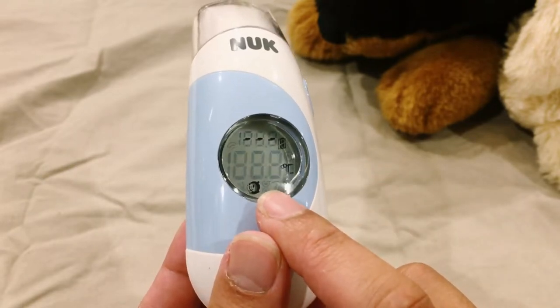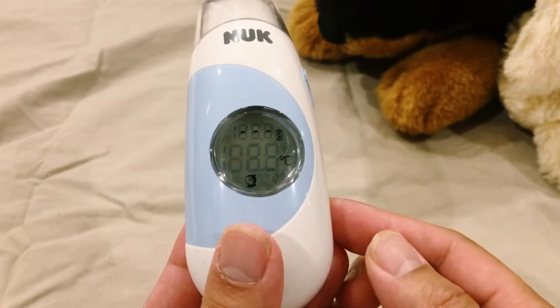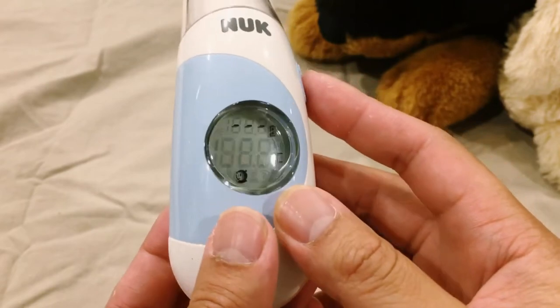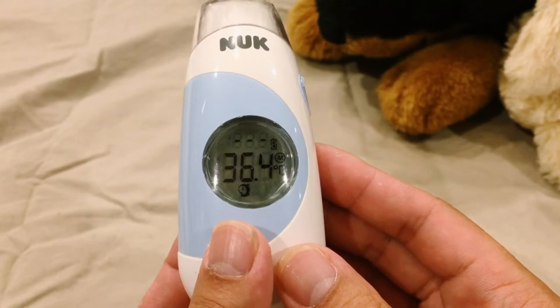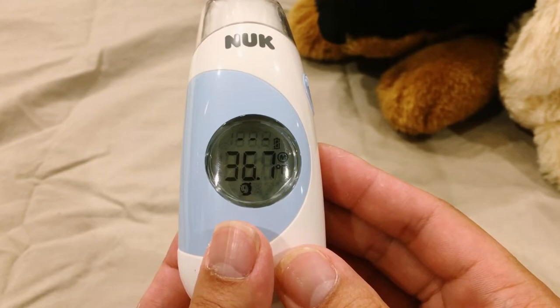That means it's ready to take body temperature. The thermometer has a history function. All you have to do is click the on and off button and then you can see the last temperature you took. Click again to see the previous one. There are a total of 25 records available.